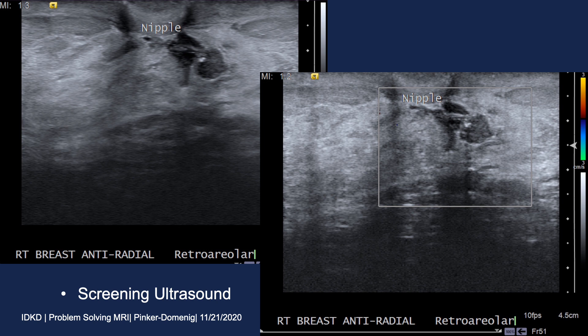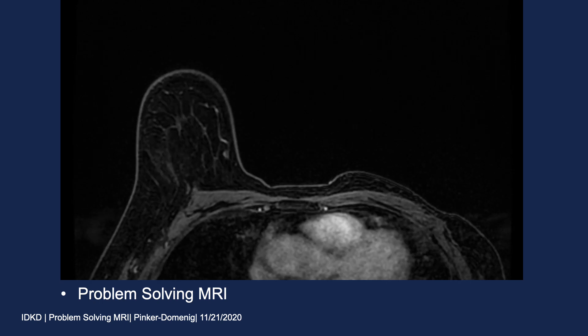We decided to proceed with MRI concurrently. If there is no enhancement and this really is debris in the duct, we would be able to confidently confirm that after MRI. A negative MRI would rule out a suspicious growing mass and she could be classified as BI-RADS benign. So she proceeded to a problem-solving MRI — by definition, this is used when you cannot answer the question with conventional imaging, and in this case the conventional alternative would have been biopsy, which the patient strongly opposed.